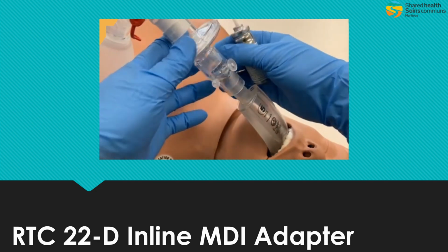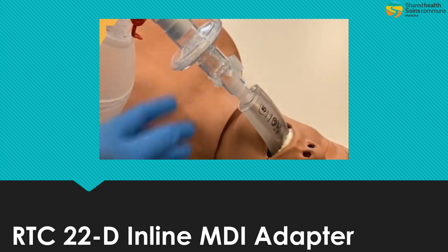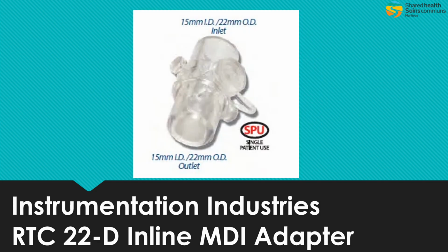Once completed, remove the canister, cover the rubber stopper back over top, continue ventilating, and repeat as required as per medication profile requirements. And that is the RTC 22D inline MDI adapter that we are going to be putting on our ambulances.